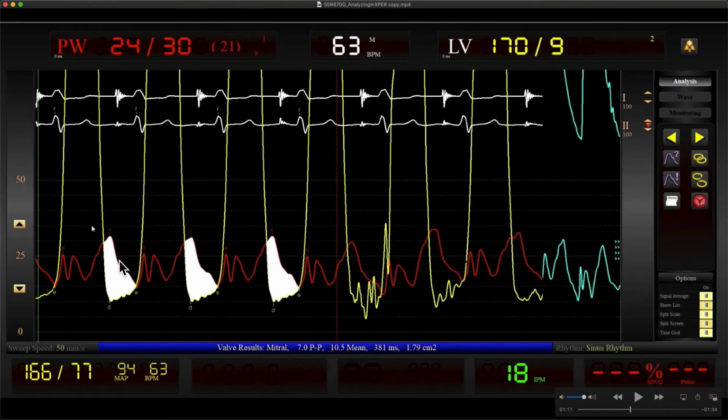The V wave is supposed to come down as the LV relaxes at the same time if you look at the left atrial pressure. So the wedge has a big delay in it. Through research, people have compared LA and wedge in the same patient and found that you have to shift the curves so this V wave peak happens right on top of the yellow LV line, and that gets you your optimal LV-LA gradient. So we're going to shift that.